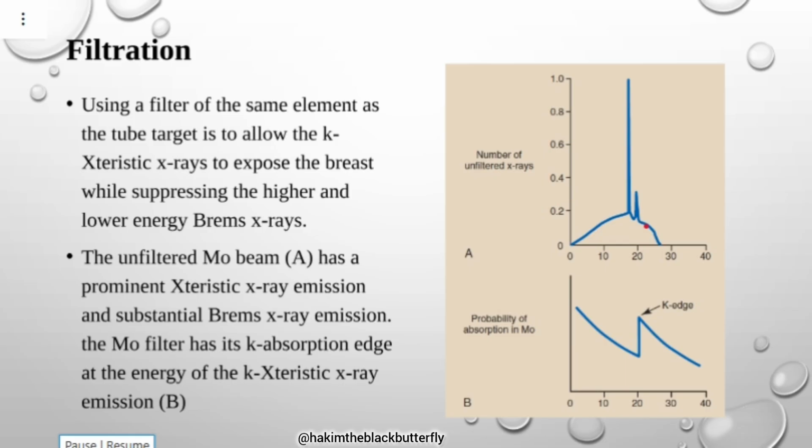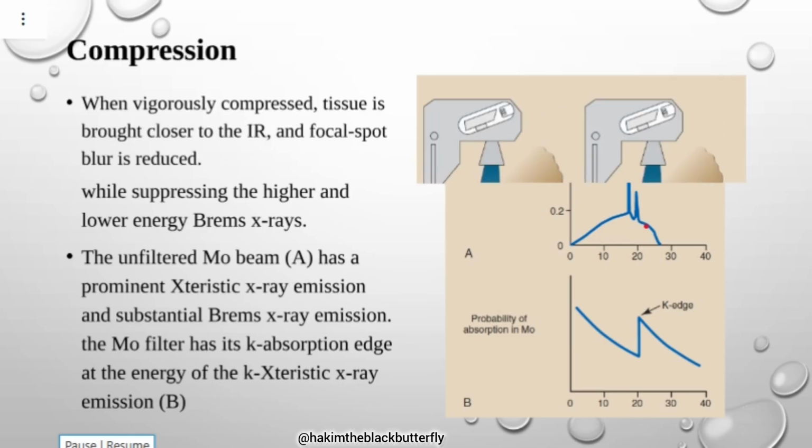Remember in conventional radiography when I was talking about compression devices, where we had a man lying on the table with a big stomach, and then they placed a compression device on the stomach to try to reduce the thickness of that stomach, such that we reduce the scatter. So the same thing here.